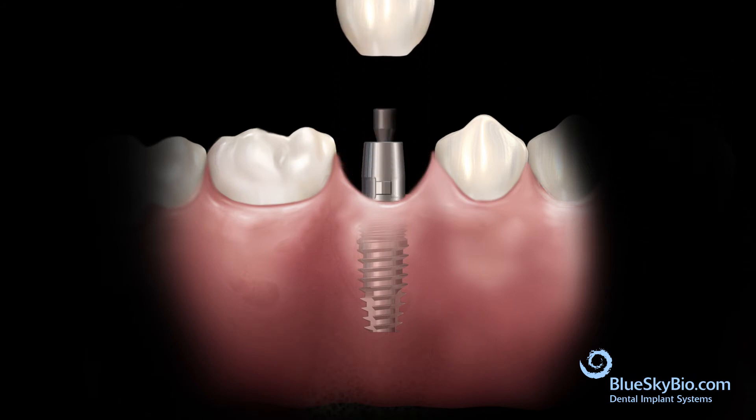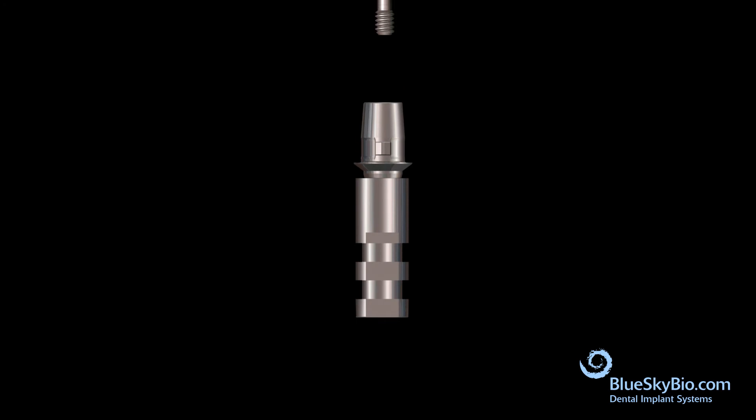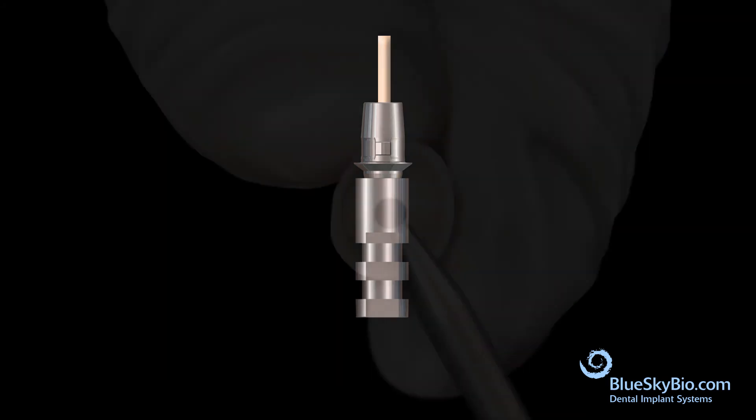Remove the crown and the abutment. Insert the titanium base abutment into an implant analog and tighten the screw with light pressure. The wood end of a cotton tip applicator is inserted into the abutment screw channel to keep it protected.